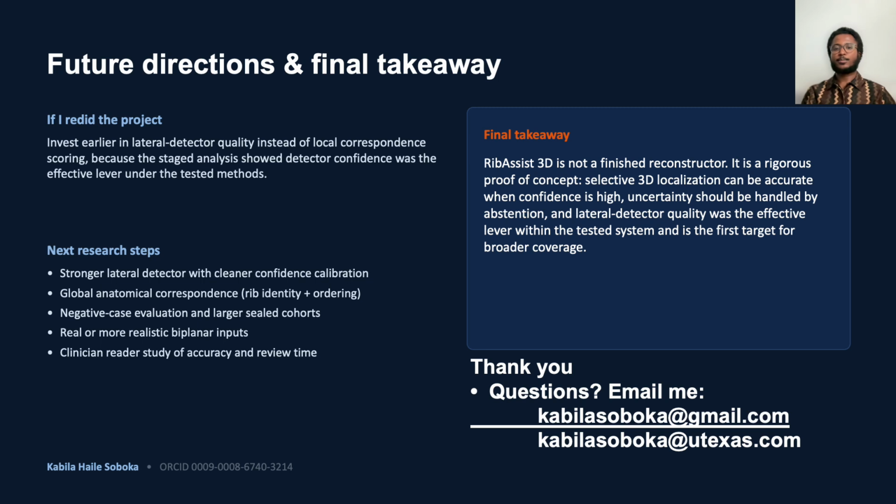If I were starting this project again, I would invest in the lateral detector much earlier. The staged analysis showed that improving the detector quality had a much bigger impact than improving the matching algorithm. From there, I would focus on stronger anatomical correspondence, larger and more realistic evaluations, and a clinician reader study.